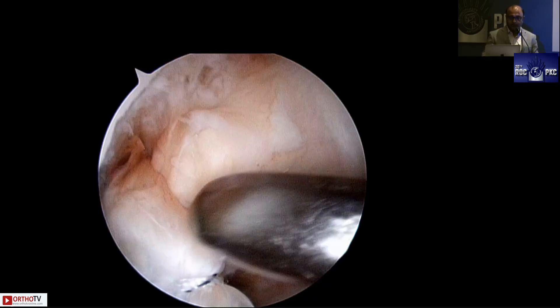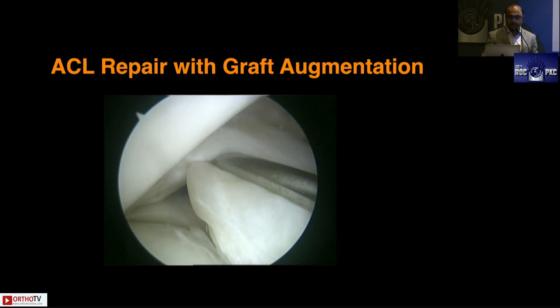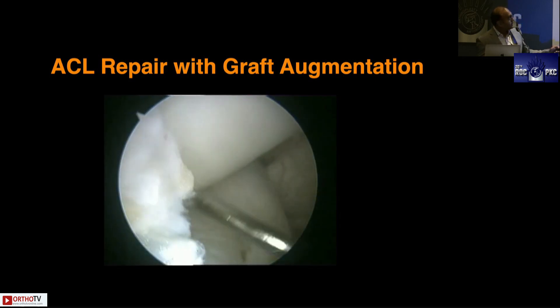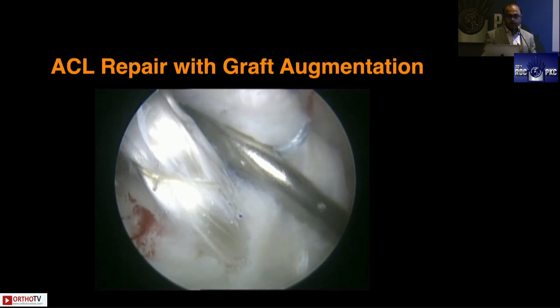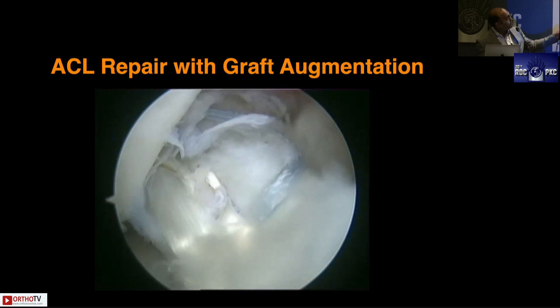Our purpose nowadays is to preserve the remnant. When there is a significant amount of remnant you don't want to take out, I use the Arthrex fiber link — I use it extensively in the shoulder for rotator cuff repair and also for stumps like this. You load the fiber link onto the shoulder scorpion, take a bite through the stump — it's a link so it creates a natural loop — and that loop is used to load onto the TightRope button. This is the TightRope loaded onto a doubled semitendinosus, because with significant remnant if you want true remnant preservation you can't have a four-strand graft; you need a thinner graft so the fiber link works as a scaffold.